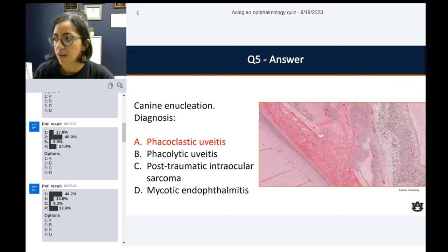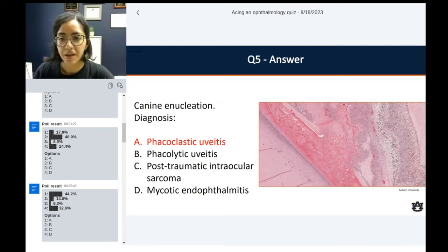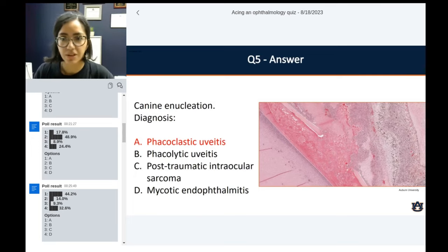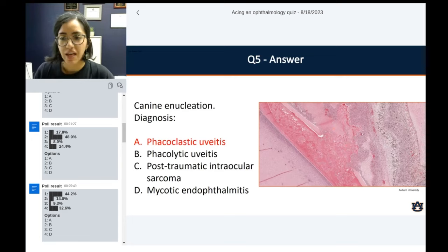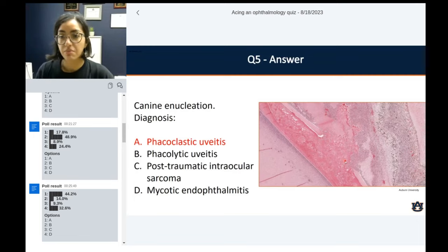This is phacoclastic uveitis based on the histo picture. What we're seeing here is the lens capsule — it is a very thick membrane, actually the thickest basement membrane of the body. It's pretty obvious that there is a rupture, a discontinuity of the lens capsule. What was supposed to be the cortical fibers or lens fibers are now just spilled over onto the chambers. All the heterogeneous business going on is your inflammatory reaction. Seeing the rupture, the blast, and the extrusion of lens material with intense inflammation — that's pretty characteristic for phacoclastic uveitis.